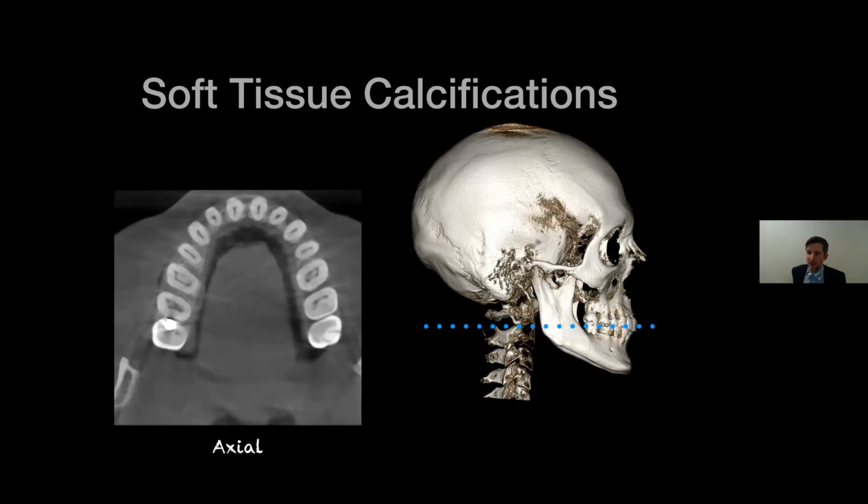Oh, thank you. So someone said Planmeca's ultra low dose protocol for 2017 is 16 microsieverts using 600 micrometer voxel size. So yeah, large voxel size, large field of view, 16 microsieverts, that is less than a pan. So that is ridiculous how low the dose is getting with some of these protocols.